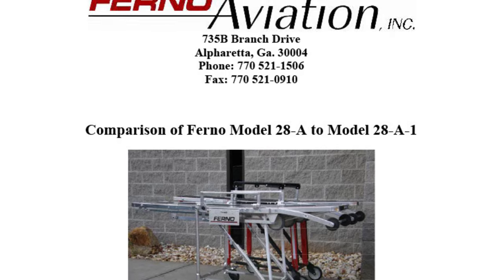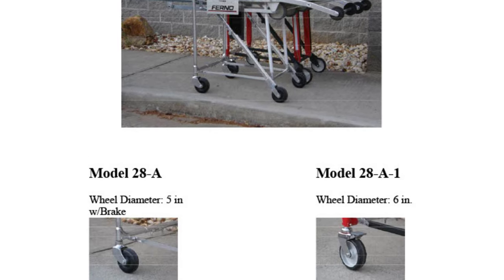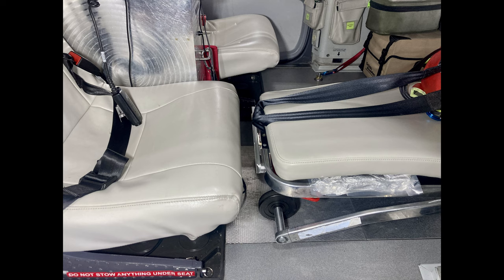Briefly, the differences are: the wheels are different — the 28A1 has locking wheels and they're a little bit wider. They also have a different sidearm; it slides down rather than folds out. The headrests are also different. Ferno says the weight of the old stretcher is 62 pounds and the new stretcher is 70 pounds — that's about a gallon of jet fuel, though I'm not sure if that's 100% accurate.